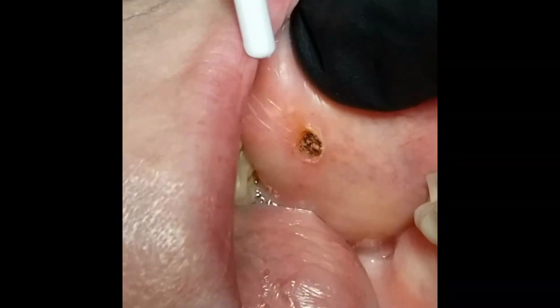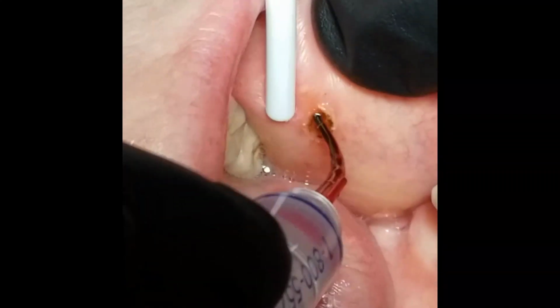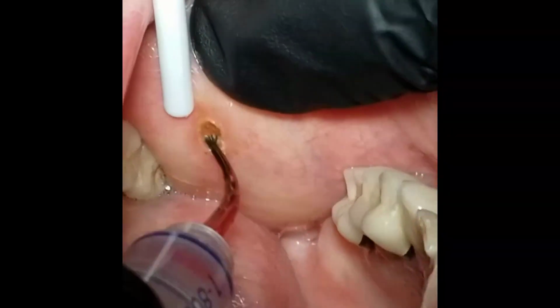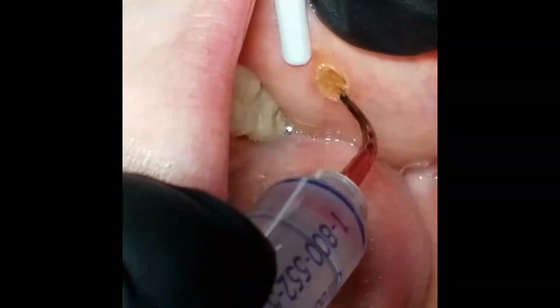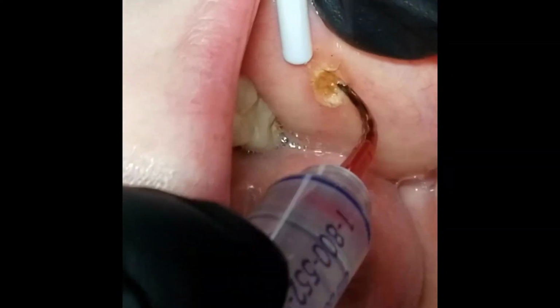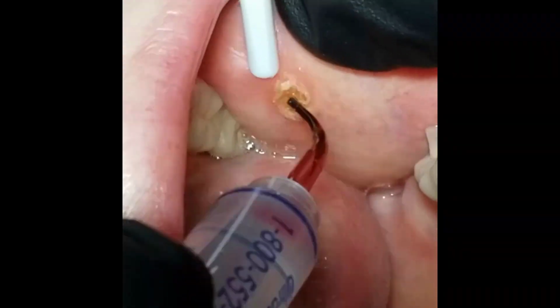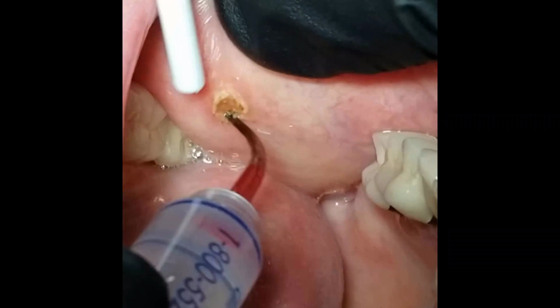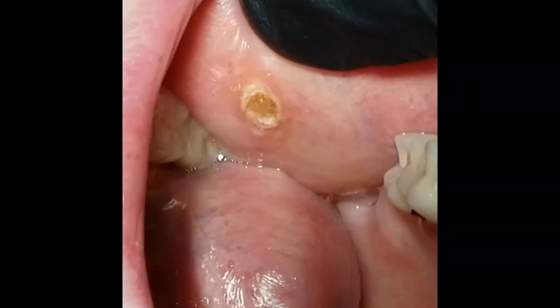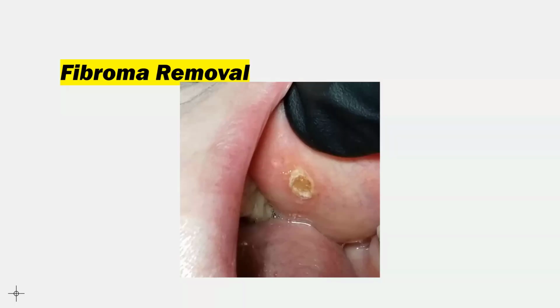You can see how beautiful that is. We're going to take a little peroxide in here and clean that up. That's another tip from Ultradent. That's an Inspiral tip from Ultradent on a syringe. And we're going to clean that up just to make sure that we get rid of all that tissue tag so it heals properly. And you can see how beautiful that incision is and how nice that technique is. And it's going to heal, like I told you, very well in a couple of weeks.